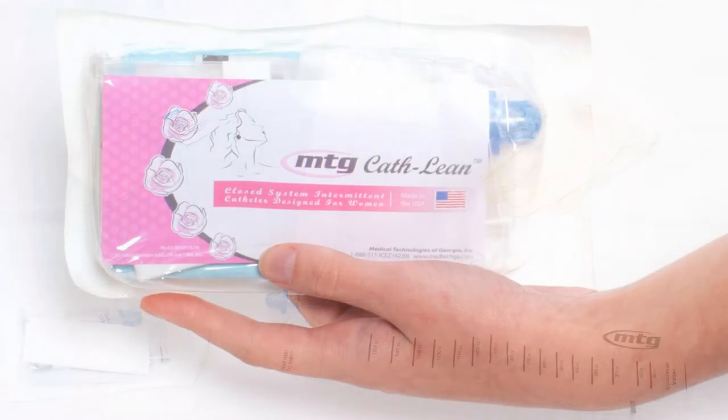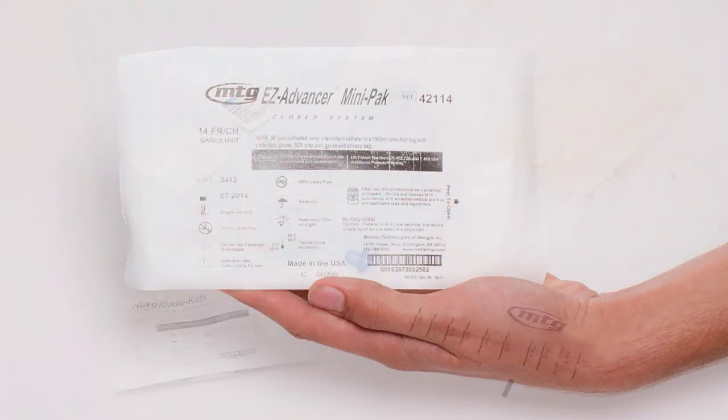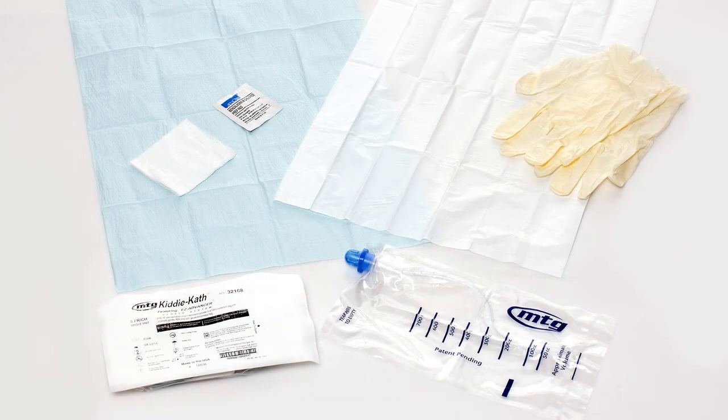MTG products are all available in Mini-Pak variety except for our Coude catheters and our Gripper catheters, but every other product we make is available in Mini-Pak. This includes the Cath-Lean Female variety, the MTG EZ-Advancer catheters, and our Kiddie-Kath products for kids.